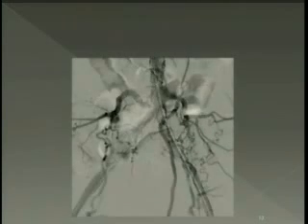Yes. So you can see the two stents. The top of the stents must be well aligned with each other in the iliac. This is going to be a simultaneous deployment, so two operators, and they must coordinate very well to start deploying the stents together. Now the whole thing is done without injecting contrast. It is already there, and we are using the frames just to see where you are.